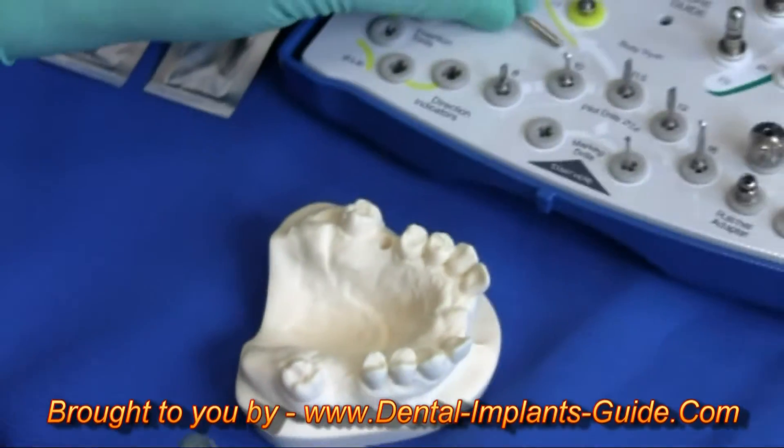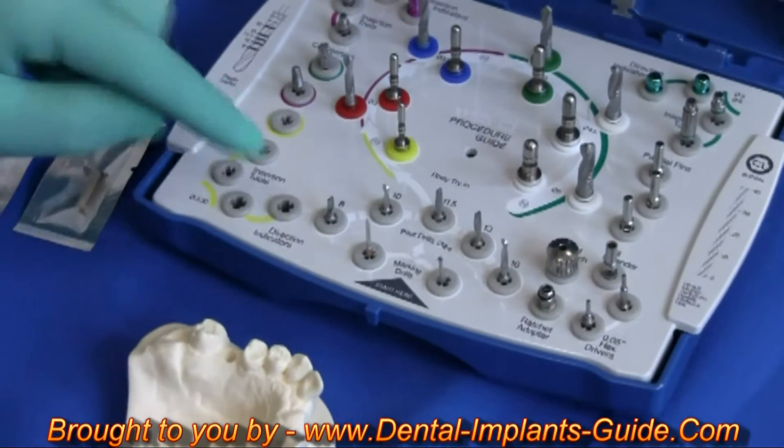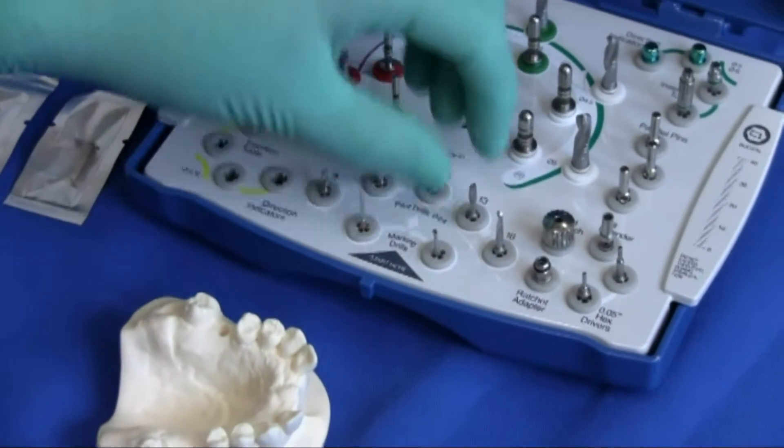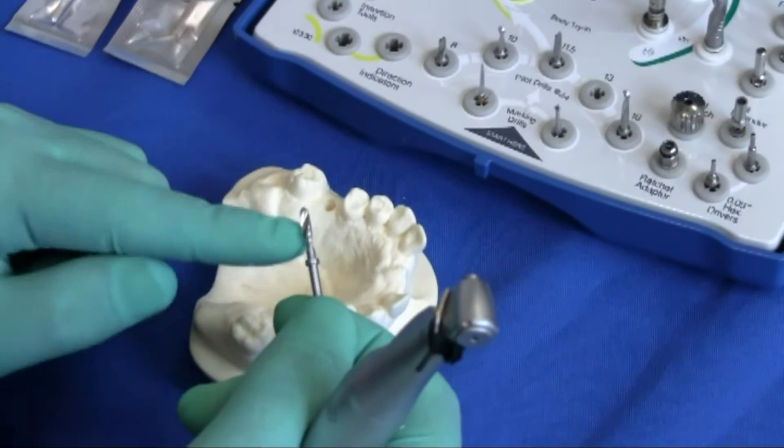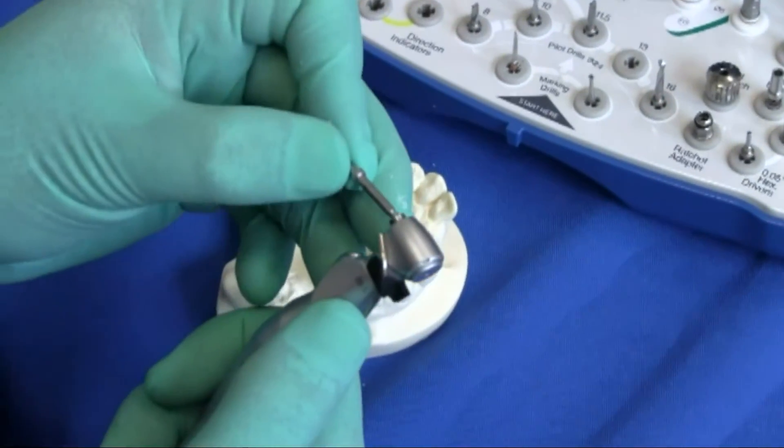Next up is the Pilot Drill. As I mentioned, we're drilling to 13mm depth, so I would use our 13mm length drill as a built-in stopper to prevent me from over-drilling.